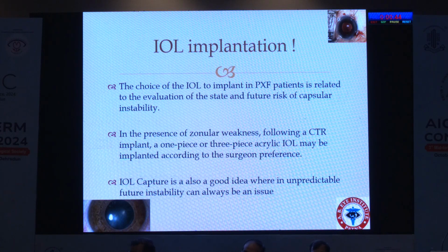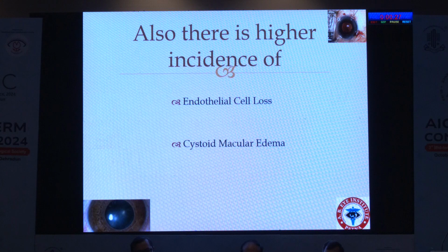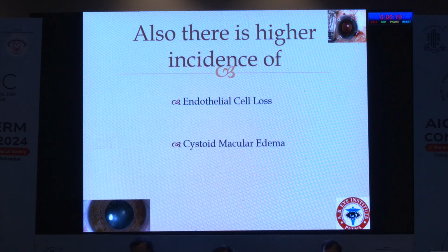In the presence of zonular weakness, following a CTR implantation, a one-piece or a three-piece acrylic IOL may be implanted as per the surgeon's choice. IOL capture is also a good idea where future instability is unpredictable, which is always an issue. In these patients, we also have to keep in mind that there is increased endothelial cell loss in patients who have pseudoexfoliation, and there is also a chance of cystoid macular edema, so the use of NSAIDs is also a good idea.